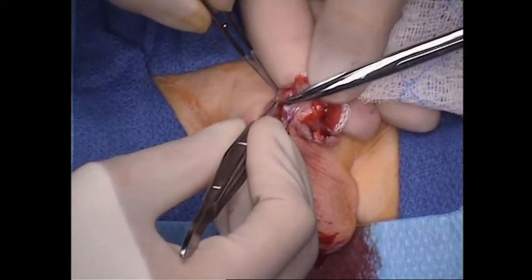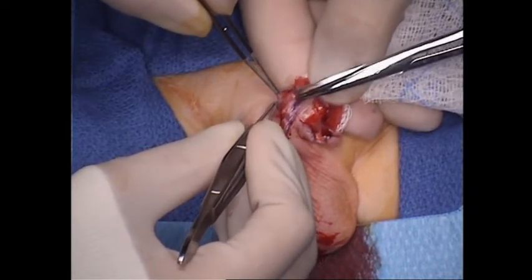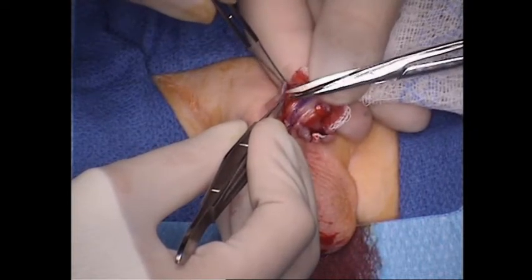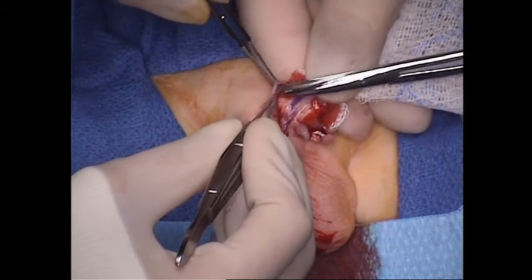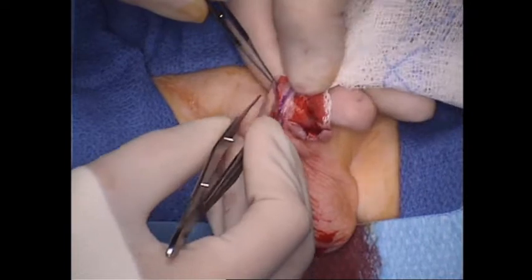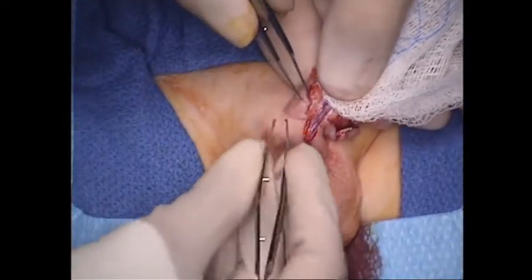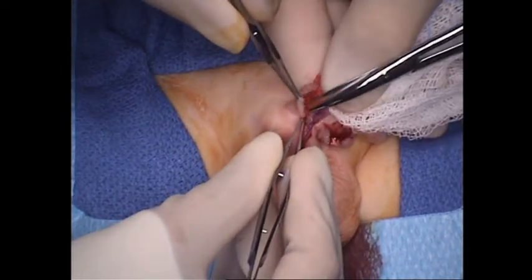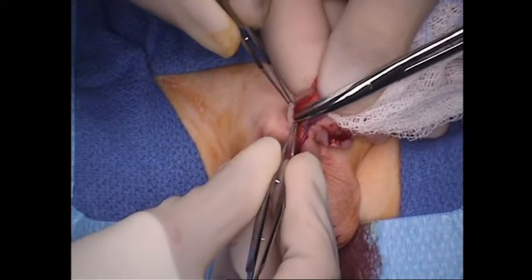This is the same plane we dissect in for our distal repairs as well, but for a different reason. We dissect in this plane on our distals because we want to preserve that ventral dartos for a coverage layer over our neo-urethra. In a patient with proximal hypospadias, we would never choose dartos tissue as our coverage layer because we've published that that's associated with a higher risk of fistulas, we're going to use tunica vaginalis in those circumstances.